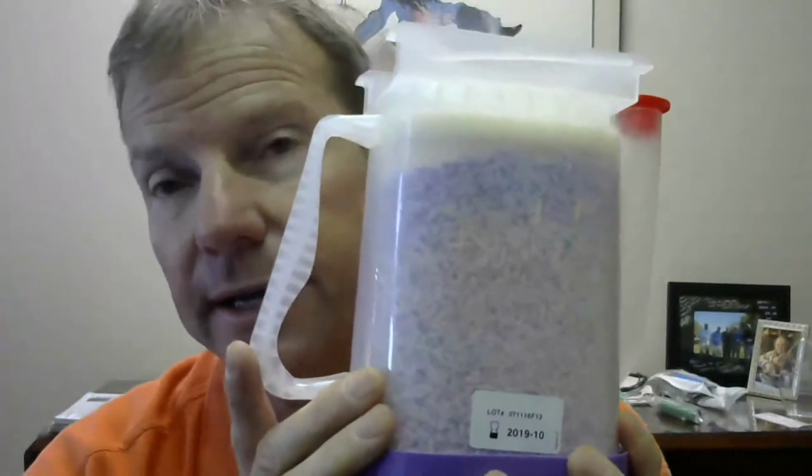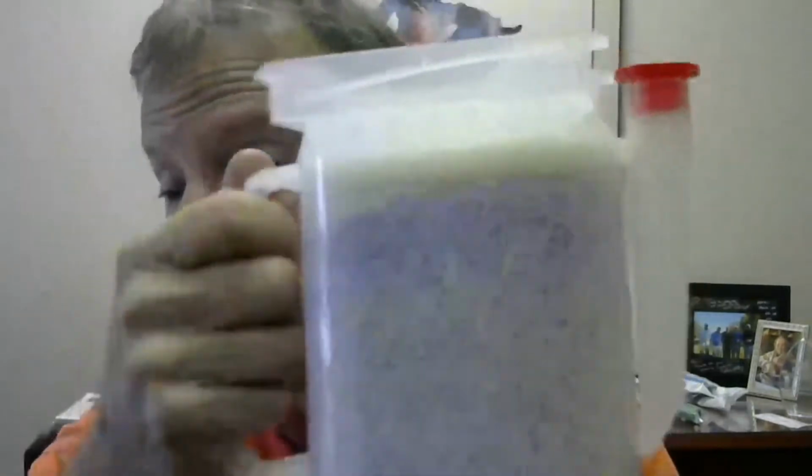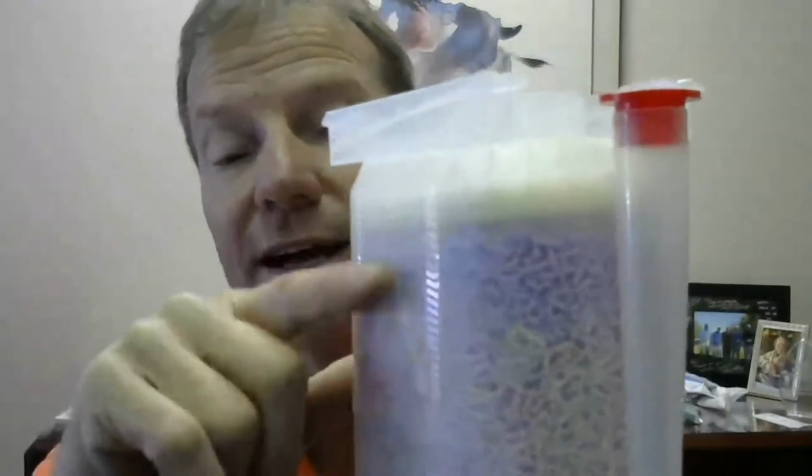And like I said, this would fit into a Mindray machine or Penlon or an Estiva. This is a beer mug version. This is what is used in most newer GE machines, such as the ACES machine, the Avance machine, the Aspire machine. I call this a beer mug. Theirs is shaped a little bit differently, but it does have a handle. You might notice this one is partially color changed, so this shows that this one was used, so it's a little bit more violet up here, and then it's slightly violet over there.